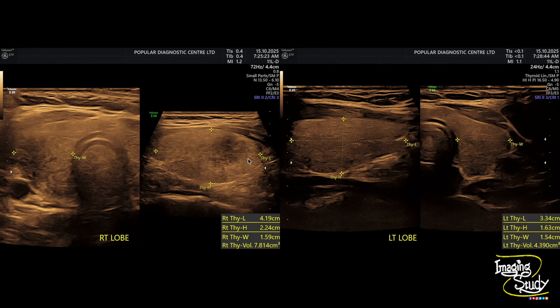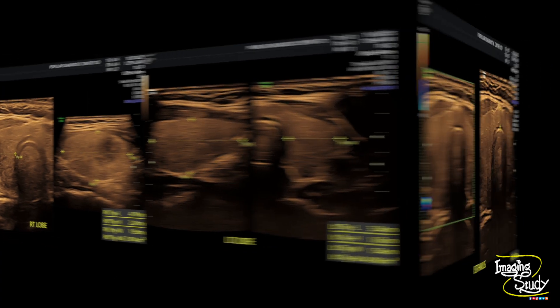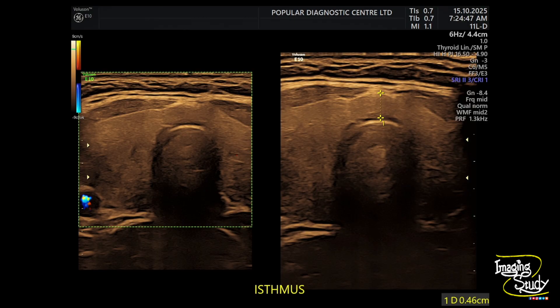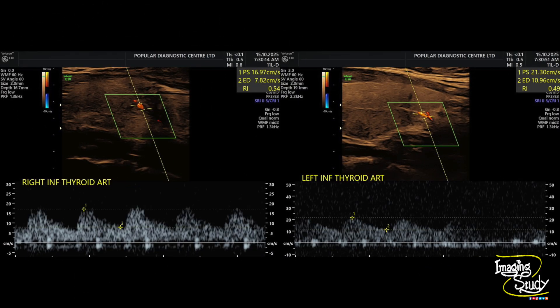You can also see some inhomogeneous texture in the right lobe. Here's the midline axial view and you can see the isthmus looks quite normal. The inferior thyroid arteries apparently show normal flow velocities of less than 25 cm per second.